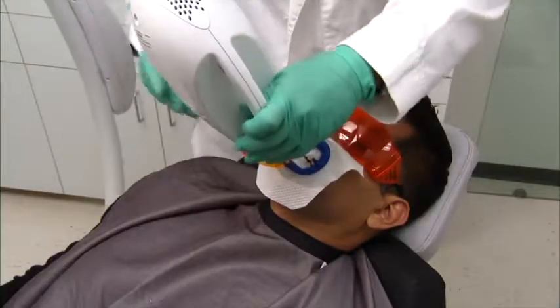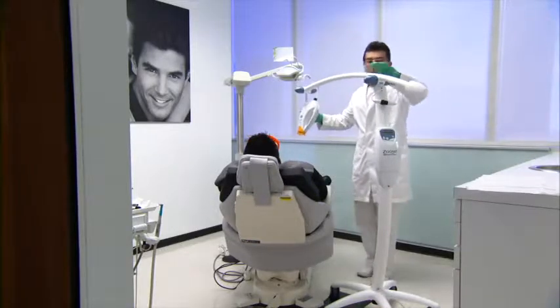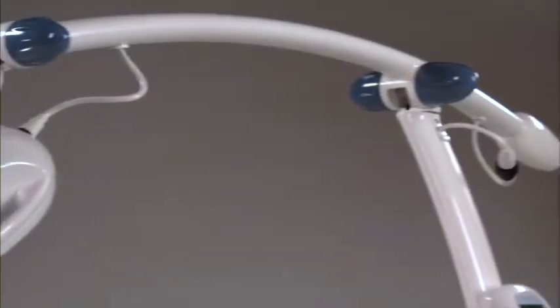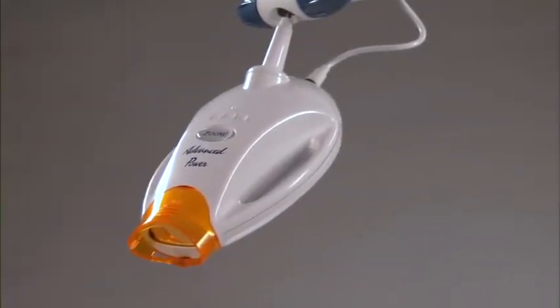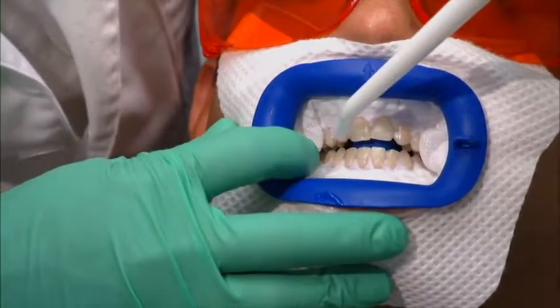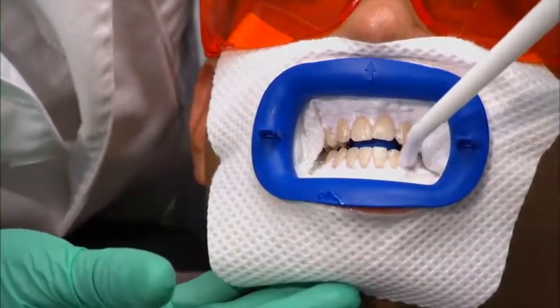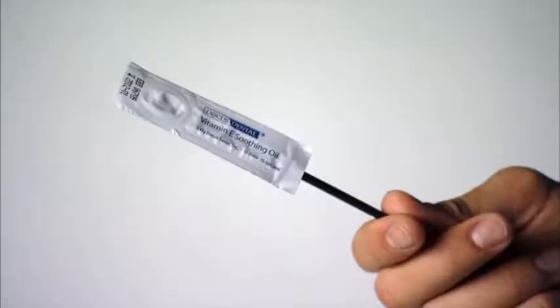After each 15-minute session, remove the light guide from the retractor and gently pull the lamp away from the patient. Avoid changing the angle of the lamp arm or head to minimize readjusting for each session. Next, carefully remove the gel with the surgical suction tip and check the isolation materials to ensure no pink tissue is visible. If the patient notes irritation at the margin, use vitamin E oil to soothe tissue.